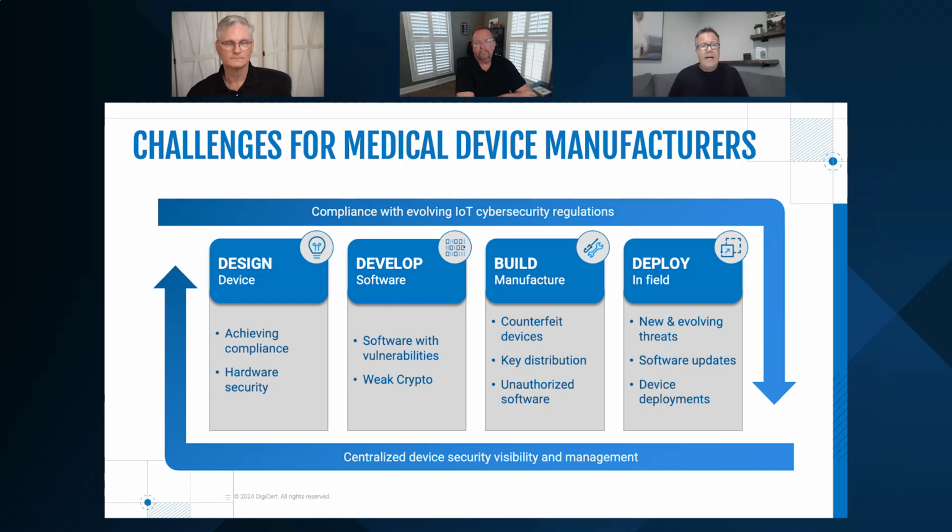the hospital or in an OR or clinic for 5, 10 years. These are expensive devices. And so the medical device manufacturer is on the hook to monitor the device for exploits, vulnerabilities, new threats, and do those updates in a timely manner. And then also, ideally, do them in a way that doesn't require a lot of outage. A lot of this equipment in a hospital, in an OR room, a lot of OR rooms are booked 24/7. And so you have to book maintenance windows on some of these devices in order to apply that patch and reboot that piece of equipment. And so there's some really unique challenges to the medical device manufacturers.